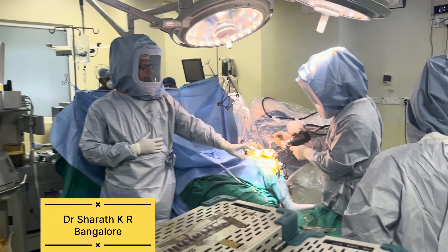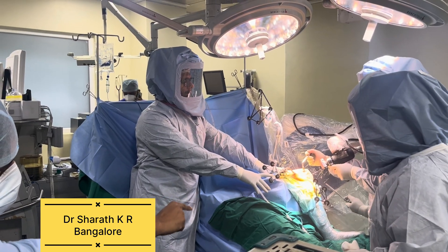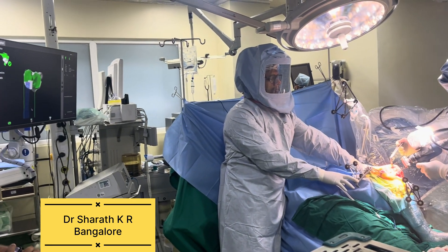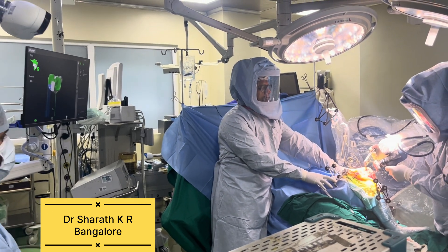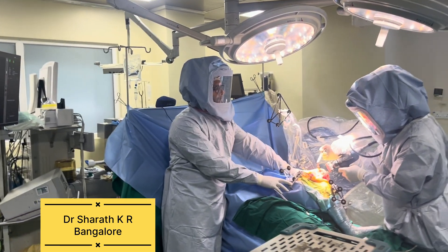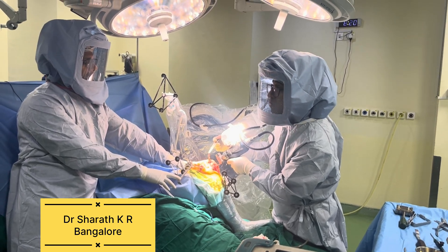Now we are doing tibial resection. You can see there is only one assistant with me. The assistant should stand away from the camera which is just above the monitor. There are some black colored structures on the robotic arm — these are arrays, which must be in line with the camera seen near the monitor. There should not be any person or object obstructing these, because these arrays give the information and the cameras take that information and compute the values.